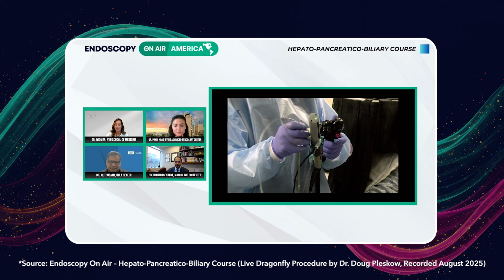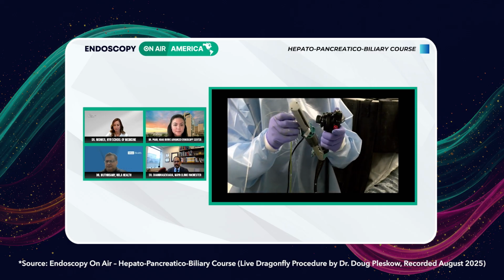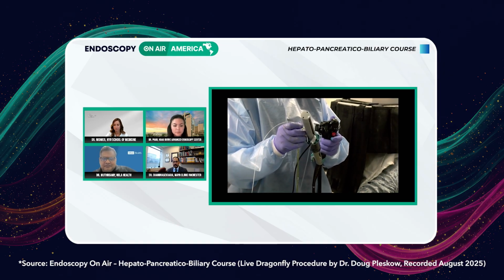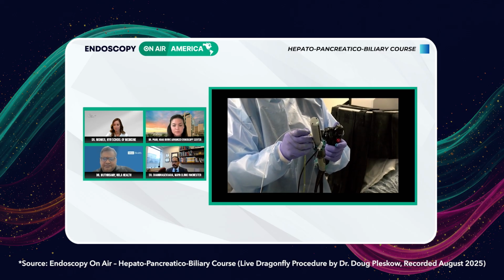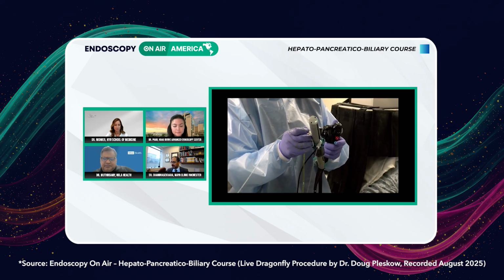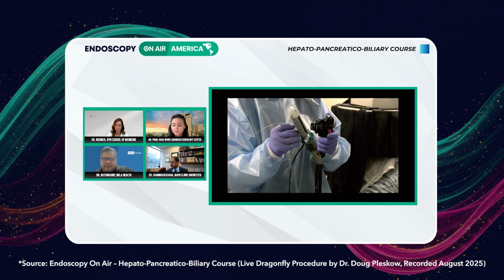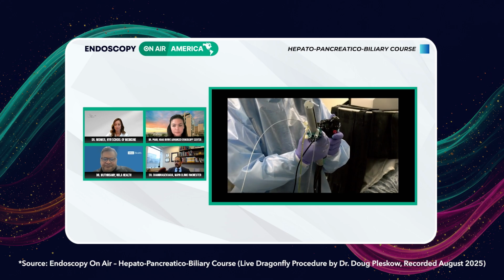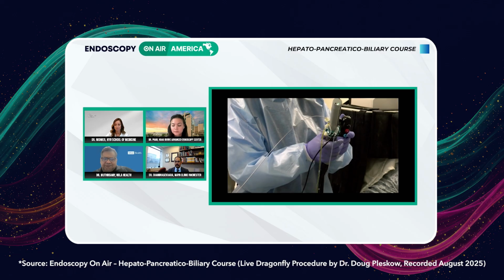Absolutely. So guys, we're wrapping up here. What's going to be your final plan for this patient? We will take 6 sets of biopsies. We'll go back up, and I always will send off samples for brushings, even though we've already done them, because we'll add FISH to our specimen, and then we'll replace the stent, and then hopefully be able to make a diagnosis by tomorrow. We'll send these off to our pathologist.